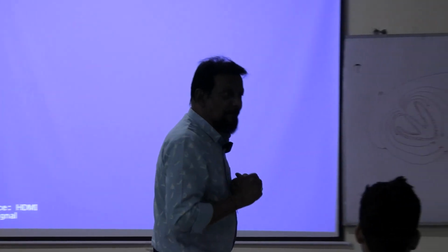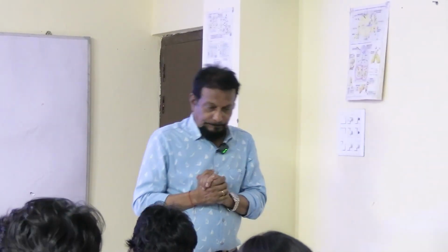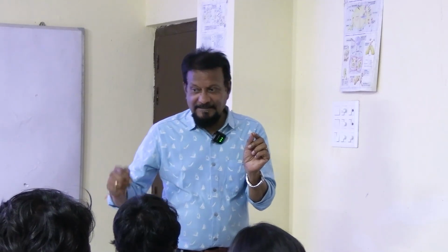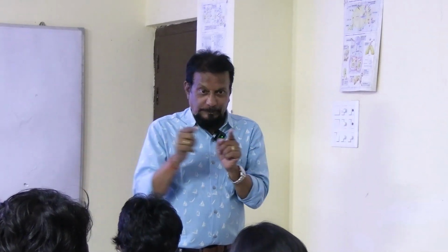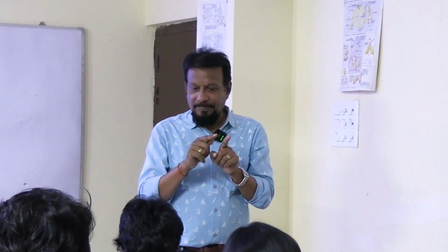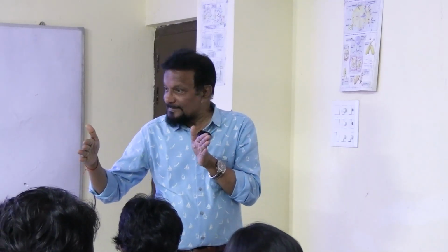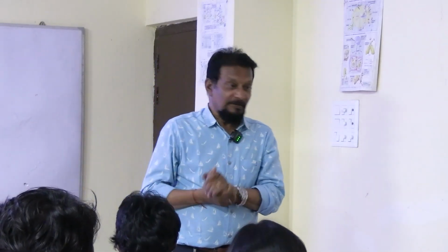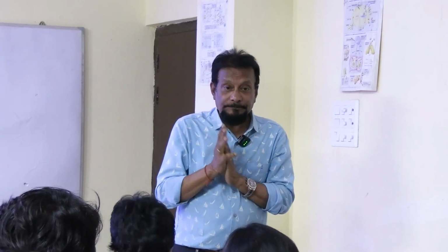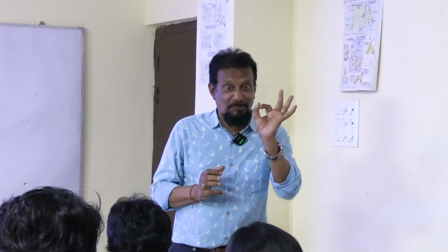And what is a segment? A segment is the ending of a wave and the starting of another wave. In between there is a time in which there is no wave. This is called a segment, like the ST segment. Very important.